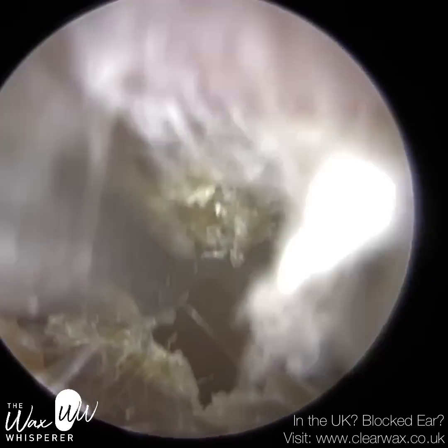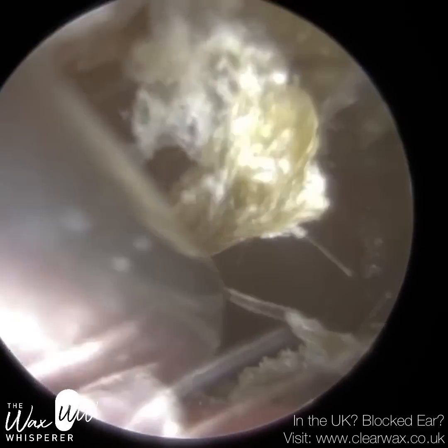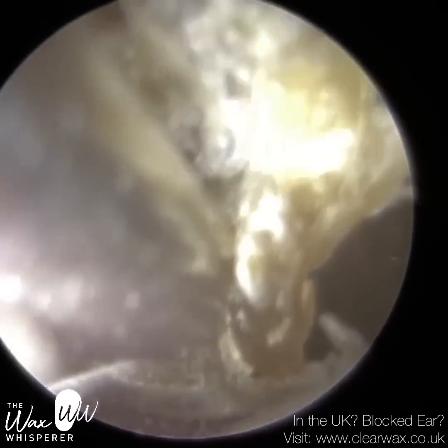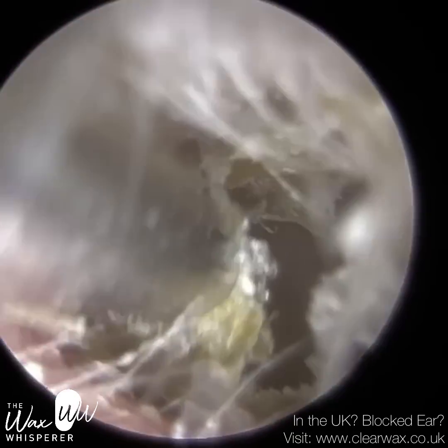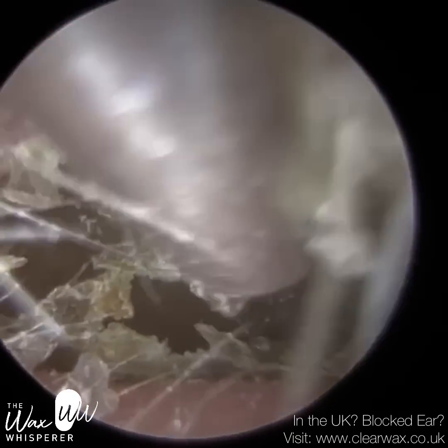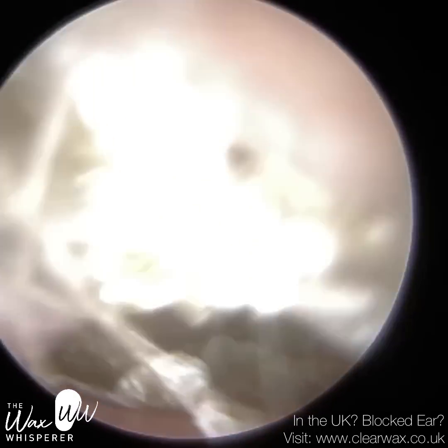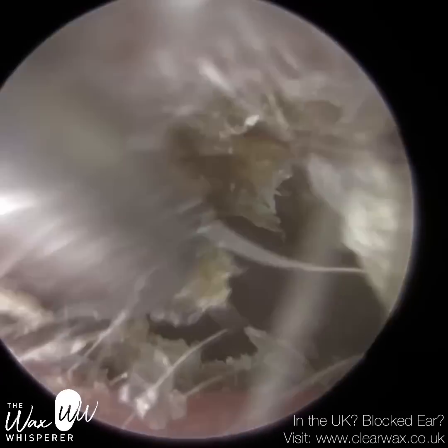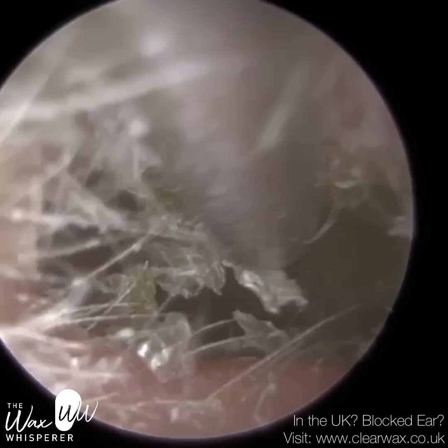The problem was, when I used the fine end here, it just got blocked — one of the downsides of a fine end is that because it's narrower, it can more easily get blocked. So I had to go back to the full-size standard suction probe. I am trying to avoid using any drops because of the otitis externa. Whenever you've got a patient with an infection, you want to avoid introducing any fluids in the ear where possible.